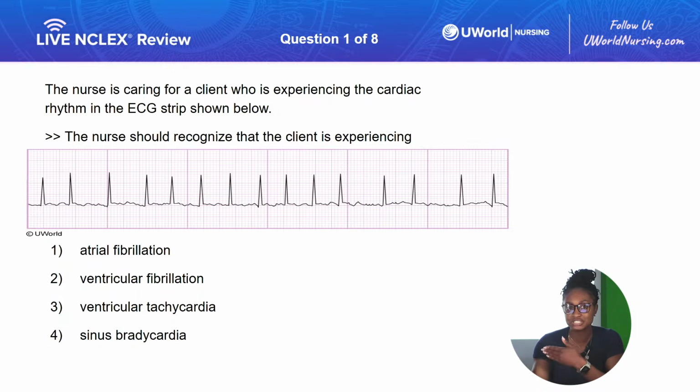So we have a lot of questions like this where it's just trying to figure out what the rhythm is, kind of knowledge and understanding. So let me know what you guys think in the chat.